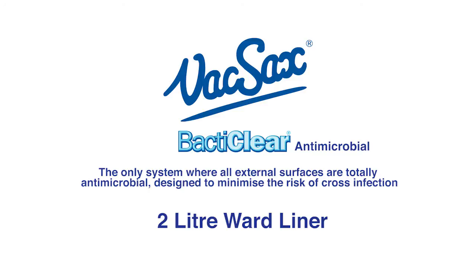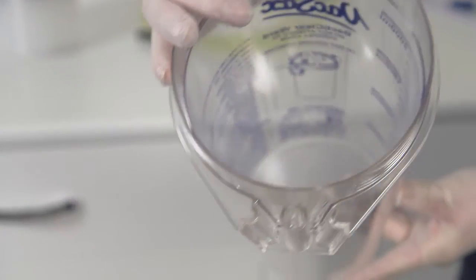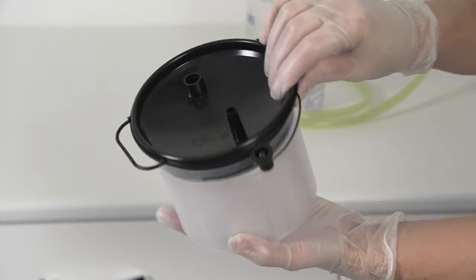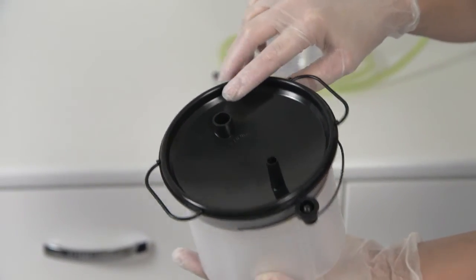The BactiClear 2L Ward Liner. For this you will need one 2L BactiClear Ward Canister with rear vacuum port, and one 2L BactiClear Ward Liner with a unique smooth surface for ease of cleaning. Note first the patient port and then the vacuum port — these are unique and cannot be misconnected.